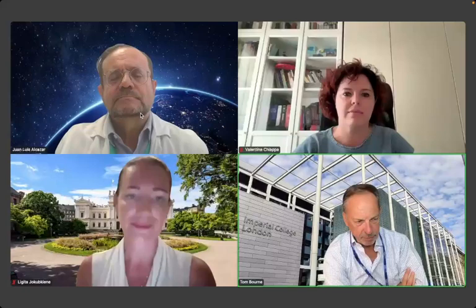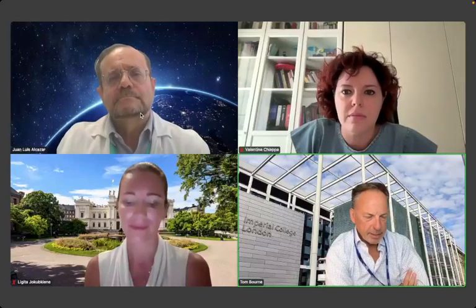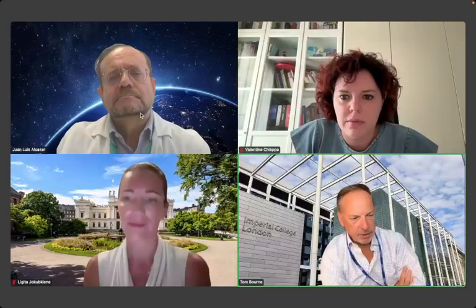One of his primary interests, and he's been very much involved in the IDEA consensus, which I'm sure JL will explain, is trying to get standardized nomenclature around ultrasound diagnostics, so that if I'm in London and JL's in Malaga, we're talking about the same thing. So if we're doing studies, that is going to make things consistent. And then from there, how to recognize these features and how they translate into clinical practice. So this is really important. JL, I'll hand over to you and look forward to your talk.